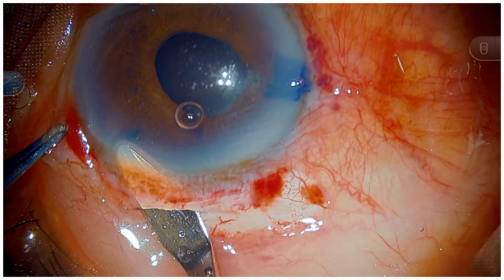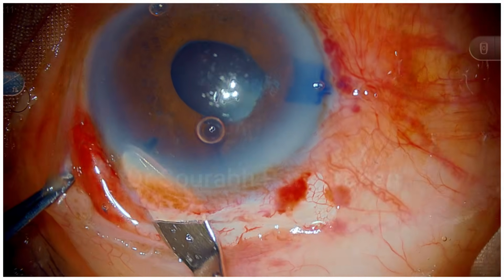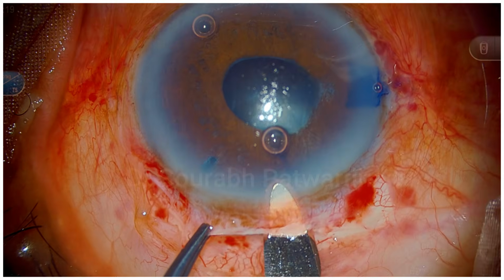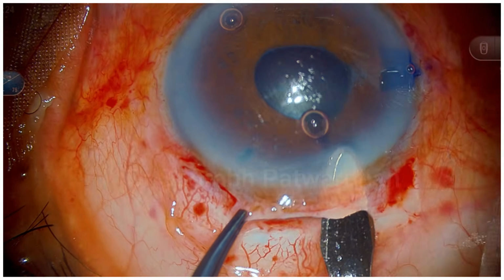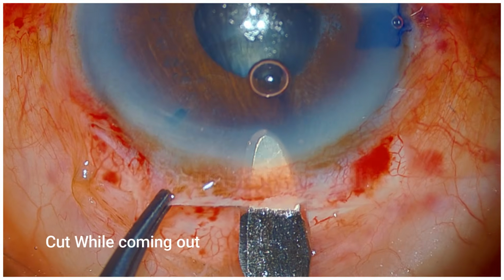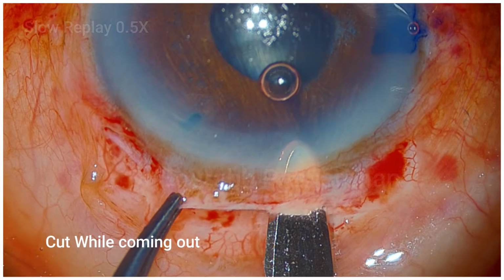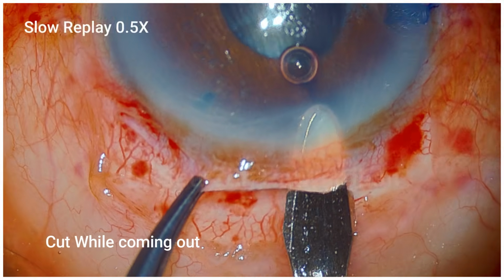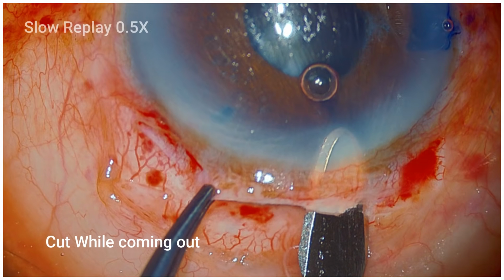And once you do that, you have to go sideways. First you go into the cornea using the crescent blade, and when you are coming out, you have to cut the sclera. So that's the movement you must master. You first go into the cornea, and the sclera has to be cut when the blade is coming out.